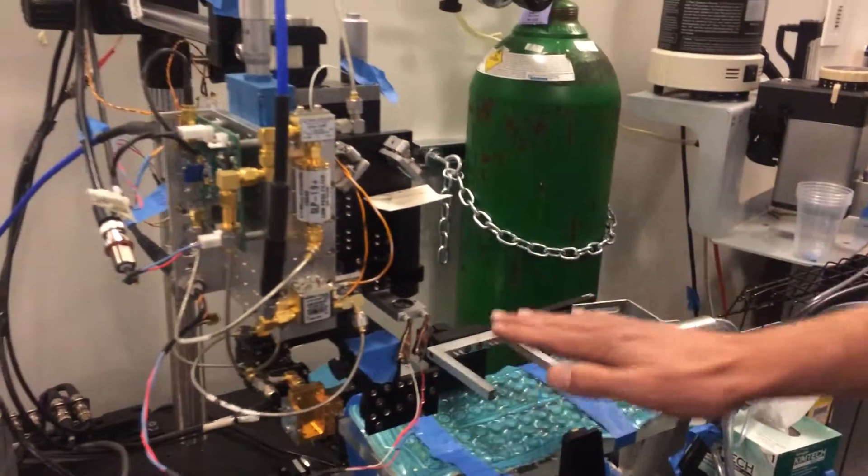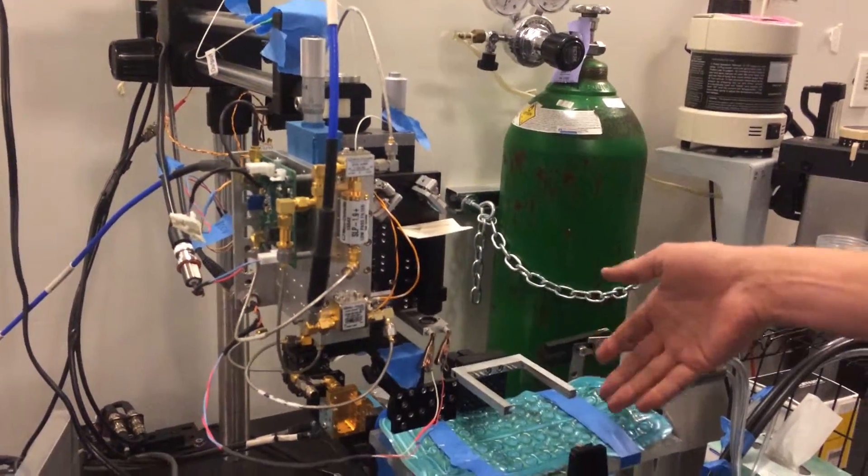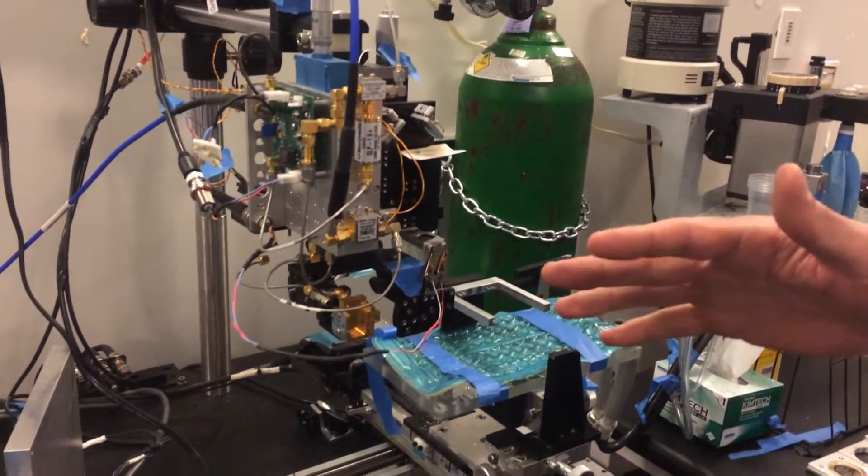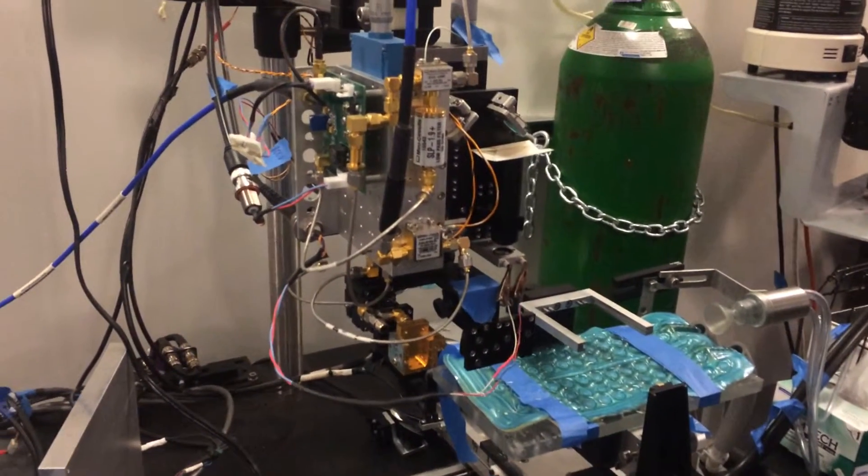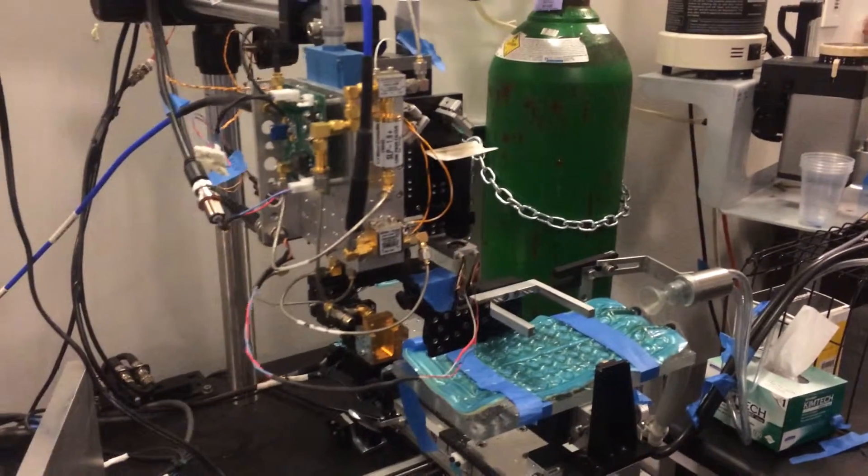And then this whole thing stays fixed and we translate the rat XY on this gantry. We take about a 50 millimeter field of view and then about a half millimeter spot size or pixel size.